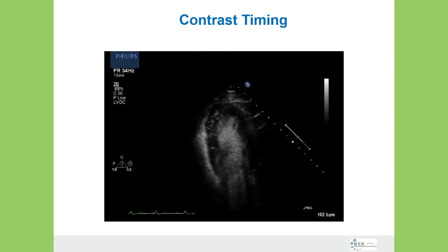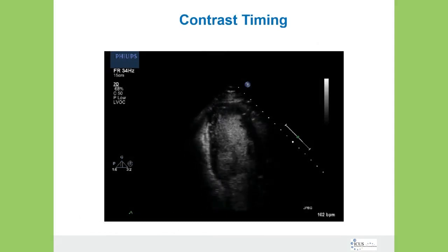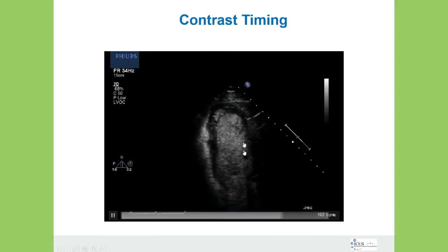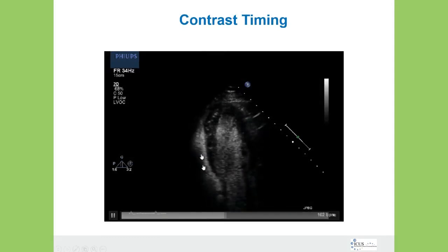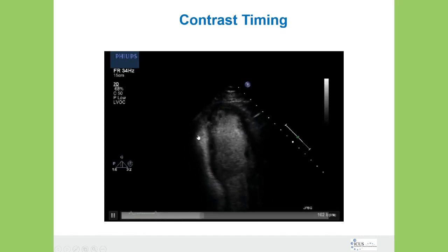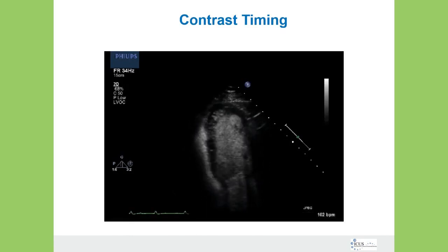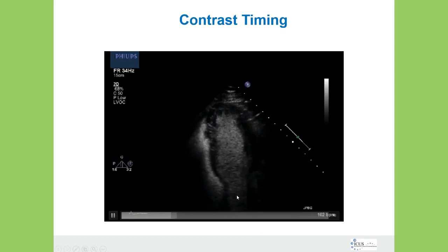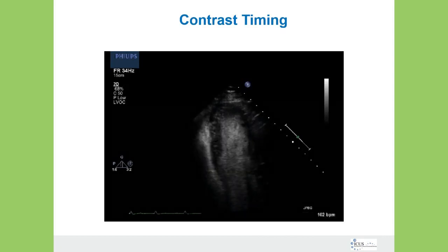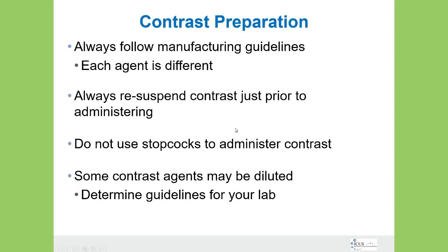Here's an example of contrast timing where it's not exactly perfect. We do see some contrast in the left ventricle, but over here we see a lot more contrast in the right ventricle. The contrast was probably just injected and we haven't given it time to get into the left ventricle in adequate concentration. You have to wait it out and let the contrast come over into the left ventricle and properly concentrate there instead of being in the right.